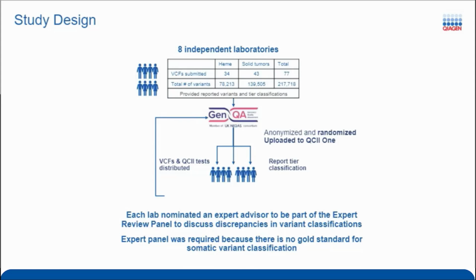I think because of that context, when you look at multiple variants together, you come up with perhaps a slightly different interpretation than if you were looking at it as individual variants, as software often does. So that's one case where definitely the biological context of a tumour did impact the way it was interpreted.